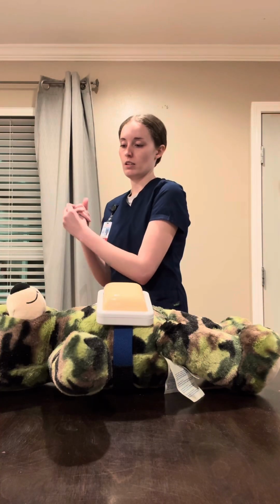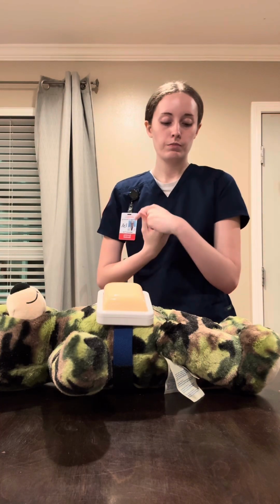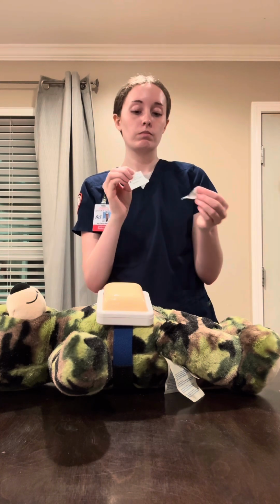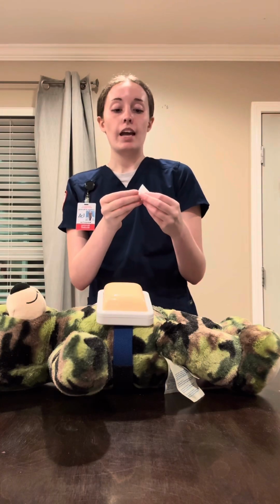Okay. And I am going to get my alcohol swab, throw that away. I am going to clean from the innermost to the outermost, making sure I don't go back over the cleanest areas.